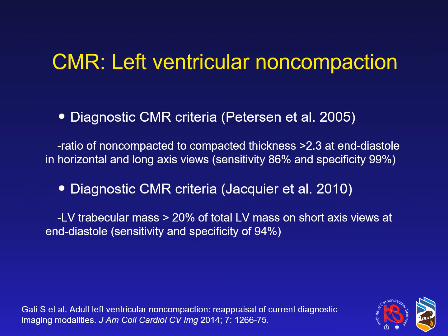The other is diagnostic criteria by Jacquier et al. from 2010, where they focused on the trabecular mass within the LV greater than 20% of total LV mass on short axis view at end diastole, and this has a sensitivity and specificity of 94%.